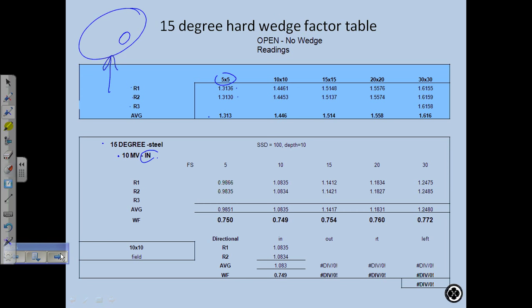Josh, let's take a vote. Trying to figure it out, like, which way's the head. Okay, this is a PA beam. The head's here, shooting this way. Here's the couch. I'm going to increase the dose on this side and decrease the dose on this side. So right wedge or left wedge? Jimmy says right. He sounds very confident. You said left? It's right.